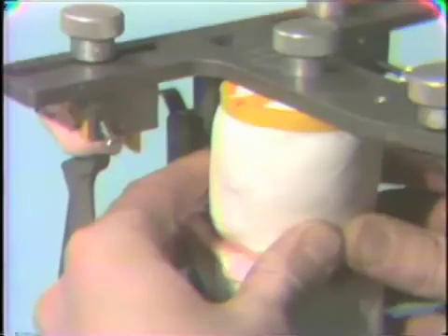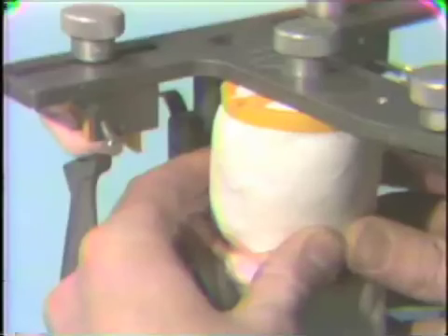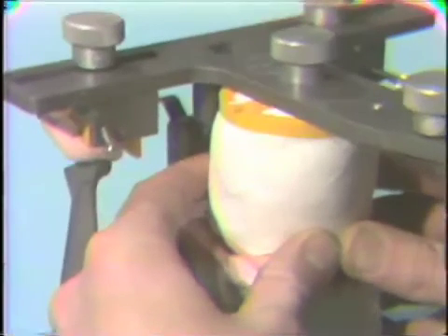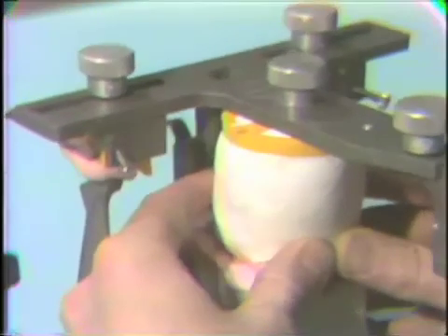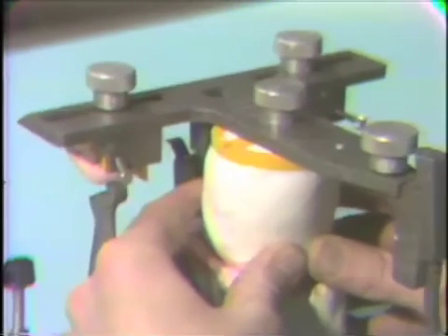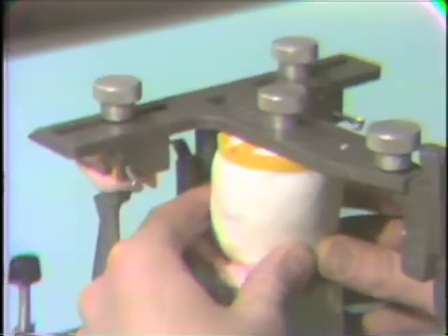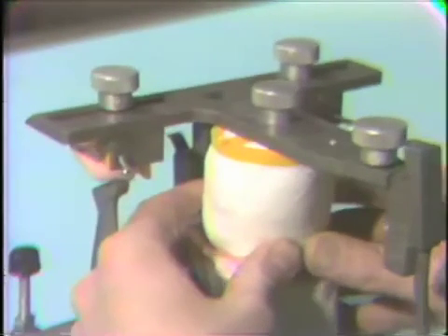This movement, our right and left border tracings, and also our protrusive movements, and the areas kind of in between on our stereographic recordings, this movement is continued until our acrylic has set in the condylar region.